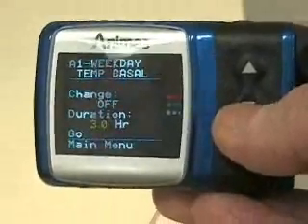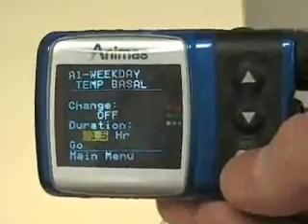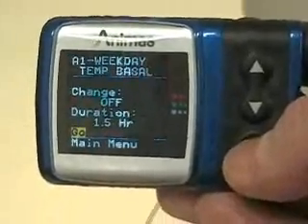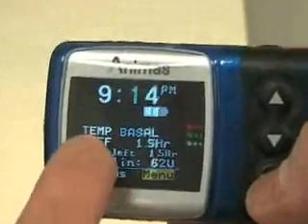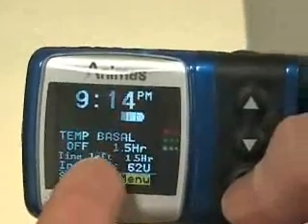I click OK to change the duration, and in this case I'm going to do the same as for the other pumps and set it off for an hour and a half. I click go, and now I'm back on the main screen. It shows that I have a temporary basal setting where it's off for one and a half hours, with an hour and a half left.